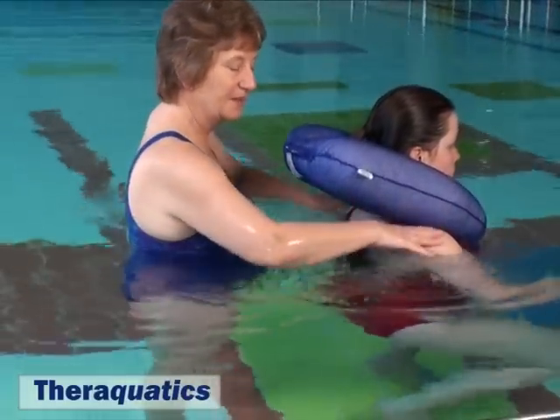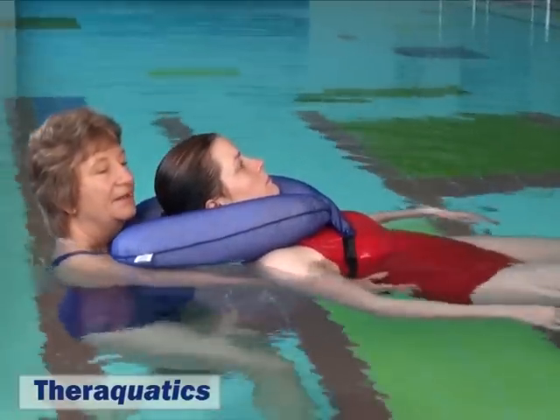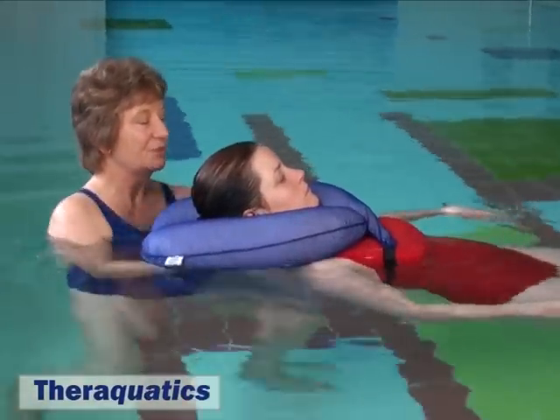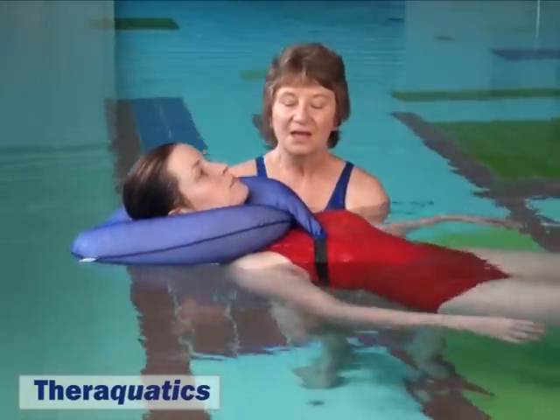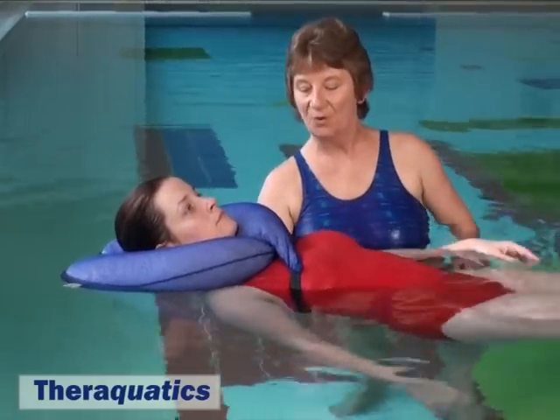Then ask the patient to submerge in the water to shoulder depth and lie back and again be comfortably supported. The strap may be adjusted quite simply for tightness should this be required.